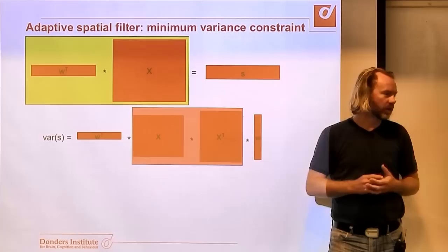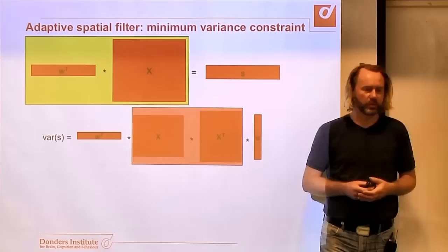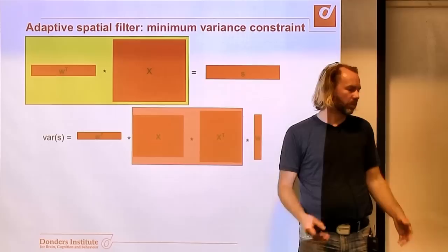But it's difficult to predict how well it works, because it's about estimating the sources of interest, but also about estimating the data that has to be suppressed. So sometimes a beamformer works on 10 seconds of data. Sometimes you really need multiple minutes, or sometimes even half an hour. It depends a lot on what you want.